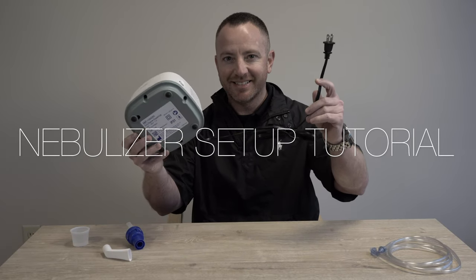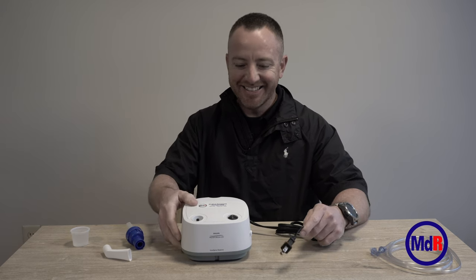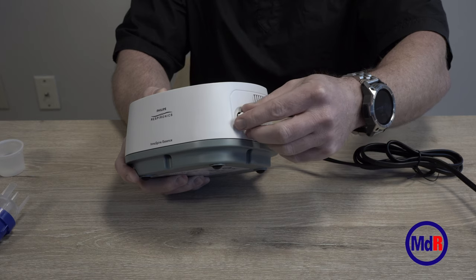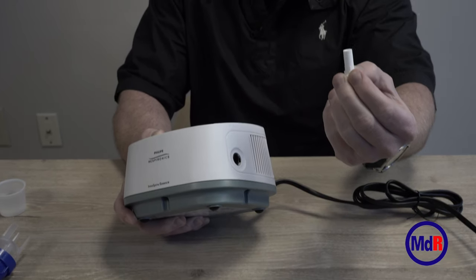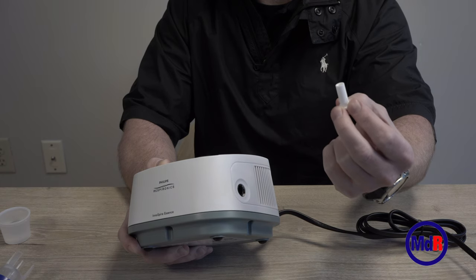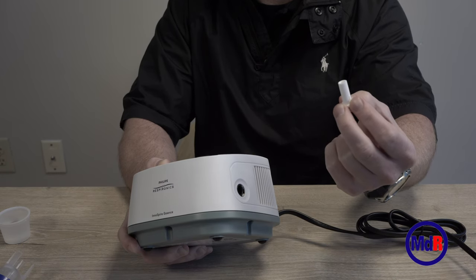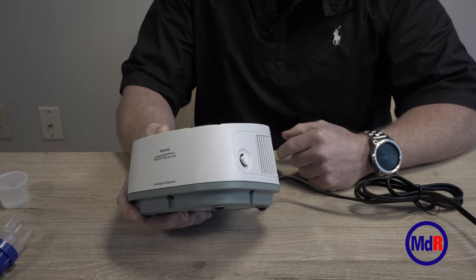This is your nebulizer compressor. It's lightweight and easy to travel with. Make sure you always sit it on a smooth, flat surface. Right here is your internal filter — it slides in and out. Check it about every six months; maybe a year and a half to two years. If it looks discolored, call your local provider.